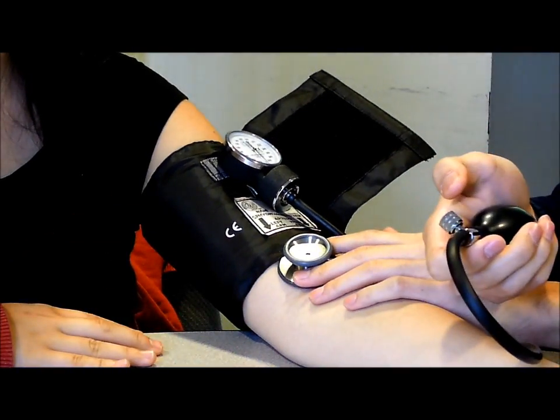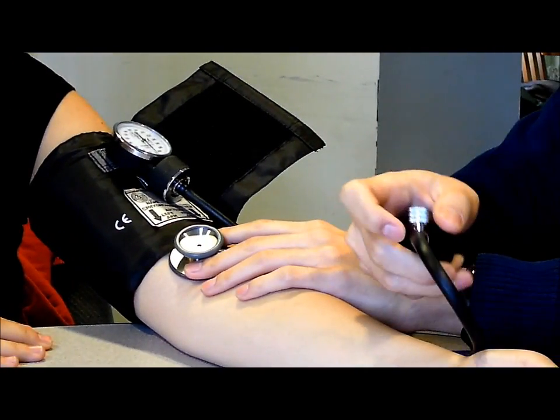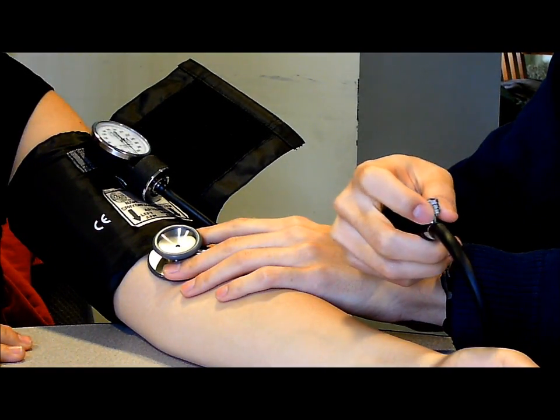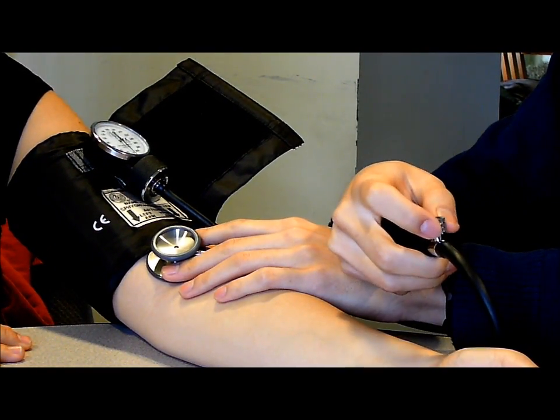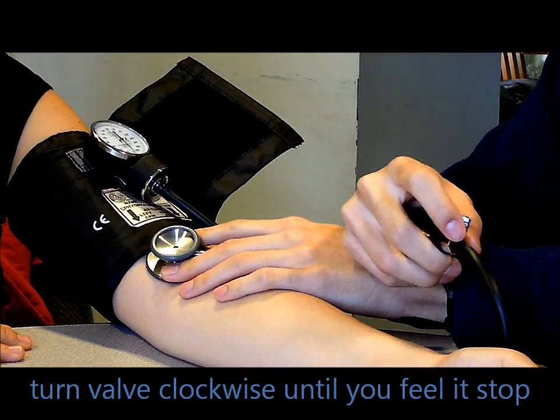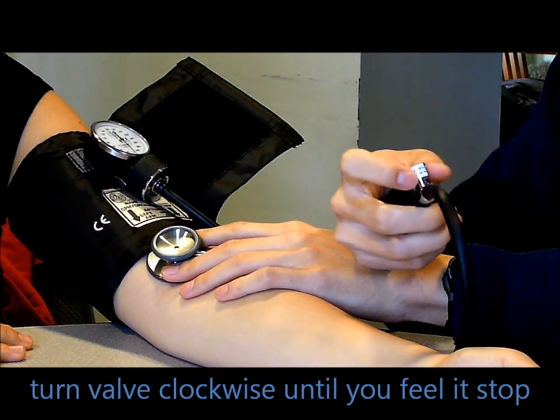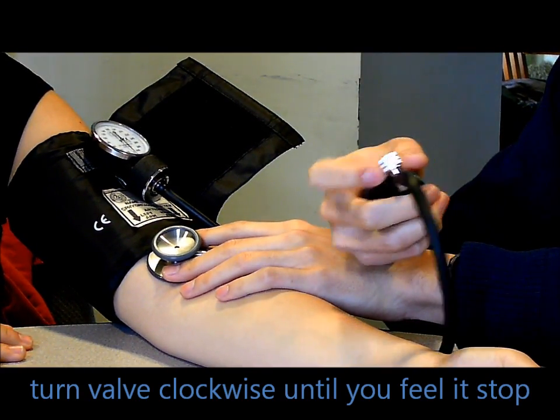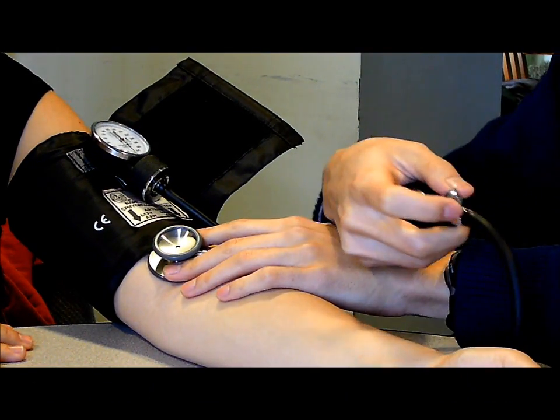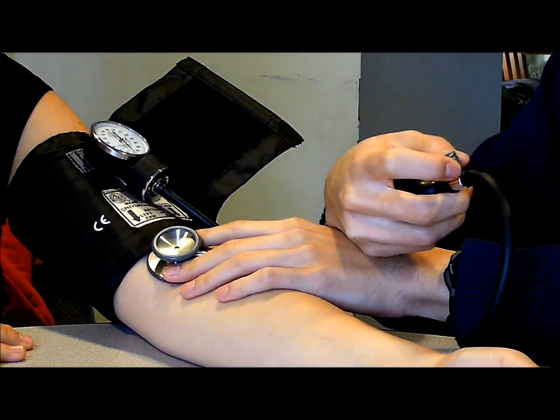Grasp the inflation pump in your right or dominant hand and use your thumb and index finger of your right or dominant hand to manipulate the air valve. First, you want to twist the valve all the way to the right or clockwise until you feel it stop. You don't want to over-tighten the valve because you want to be able to carefully control the amount of air escaping from the valve as you decrease the pressure in the cuff. So again, twist the valve all the way clockwise just until you feel a stop, and then stop.